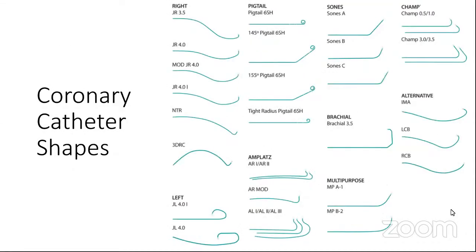There are many types of coronary catheters used for both diagnostic purposes and a whole lot of others for intervention or guiding catheters. The most important used are the JR, or the Judkins right, 4.0 or 3.5. This is for the right system, and Judkins left for the left system. Sometimes I've seen Amplatz used. It's beneficial in that it can engage either ostia.